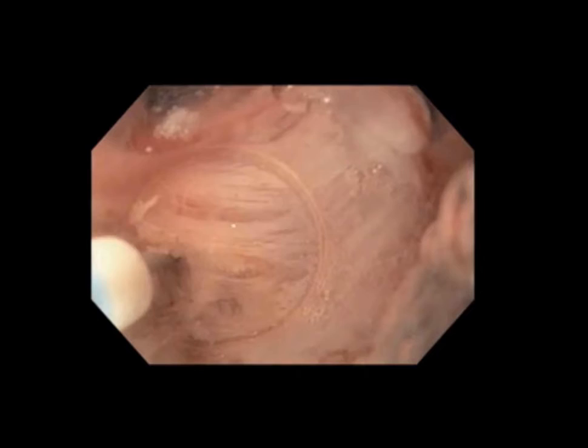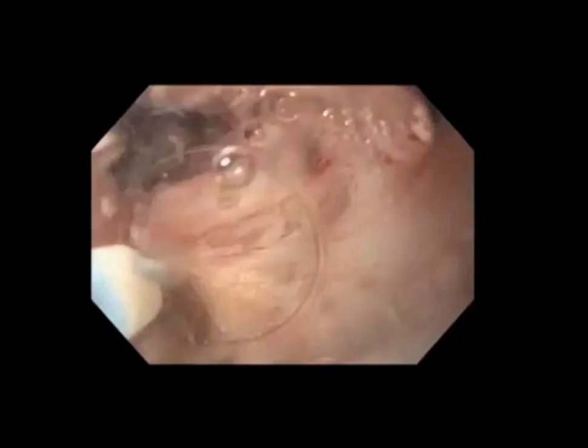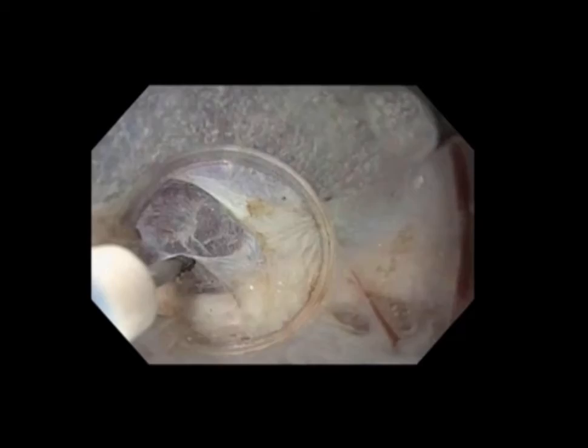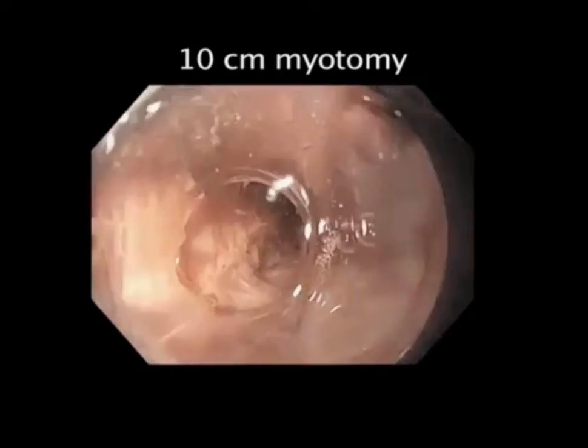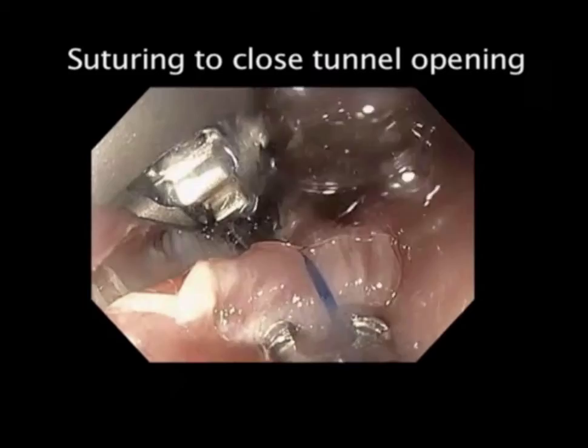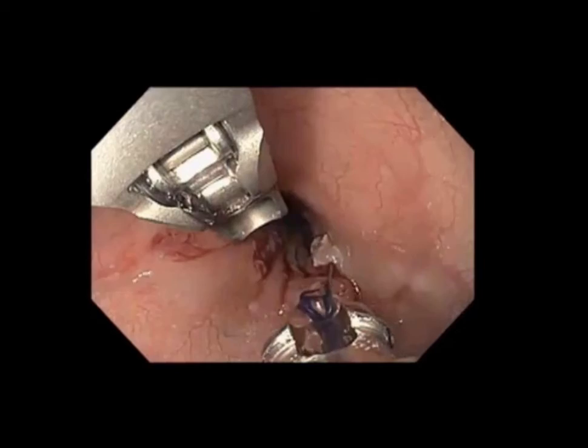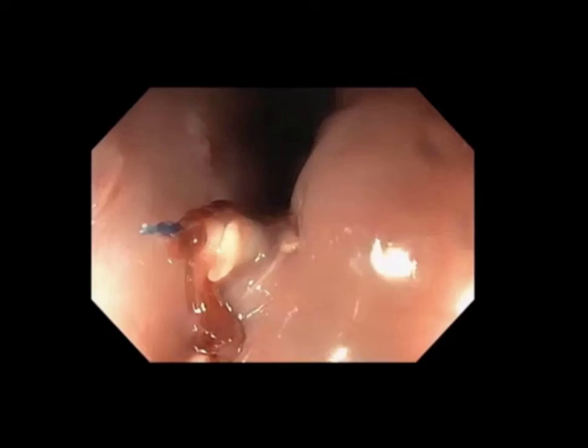We continue our dissection of the circular muscle layer at the GE junction. As we get down to the cardia, the fibers tend to crisscross and become a little more disorganized. It's very important to orientate ourselves precisely at the muscularis propria, making sure we do not accidentally injure the mucosa. Once we have completed our 10-centimeter myotomy, we withdraw the endoscope, switch on the gas, and close the tunnel opening using the suturing device mounted on the tip of the scope. We place three interrupted sutures for a robust, seal-tight closure.